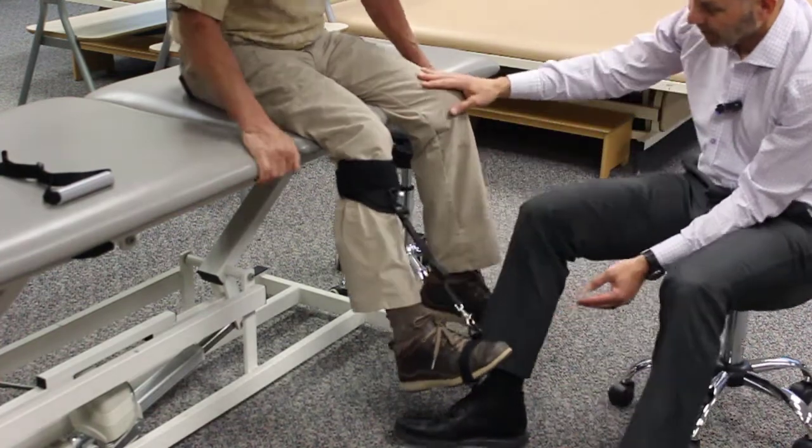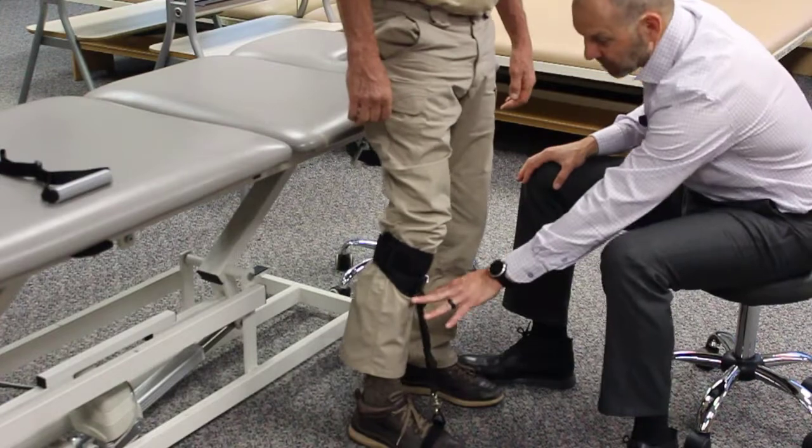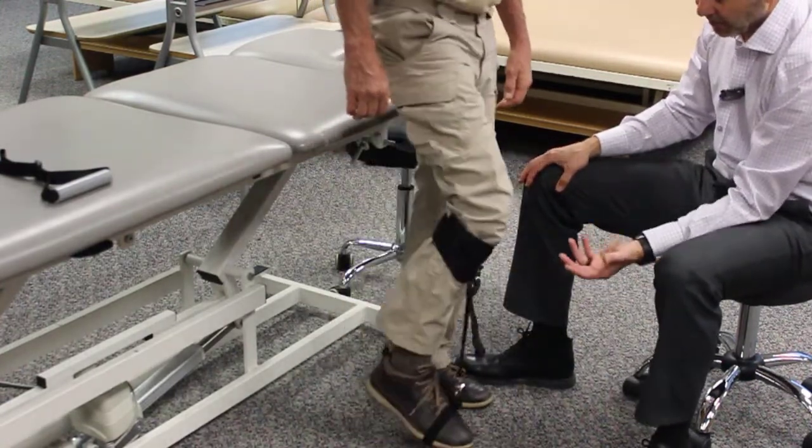So go ahead and just stand up for me. And so if you were to take a step now, we could just use it just like this, walking on a treadmill, and that's going to help provide some toe lift.